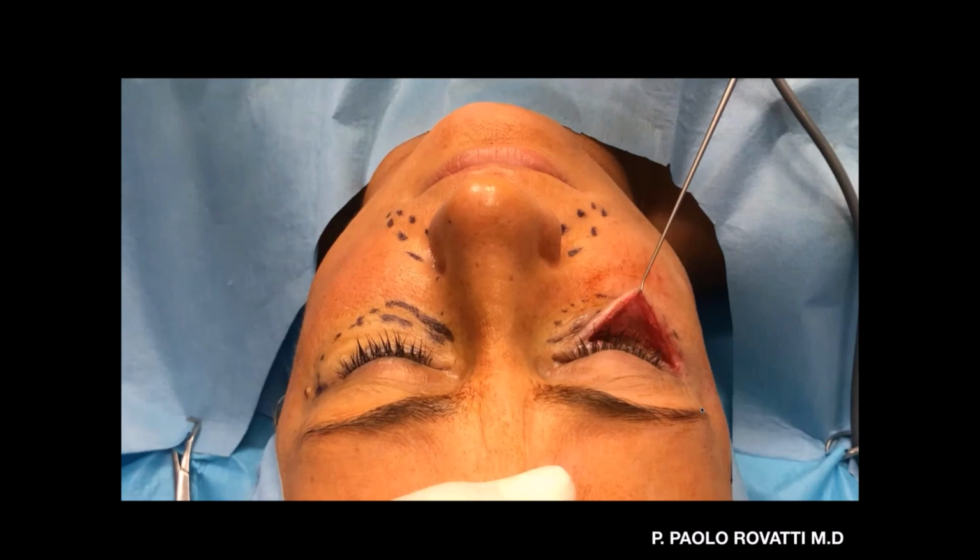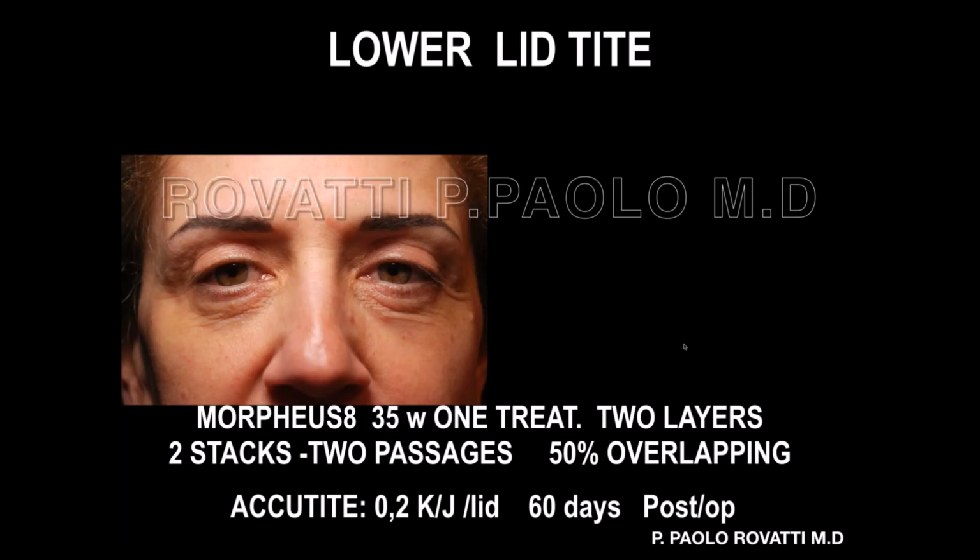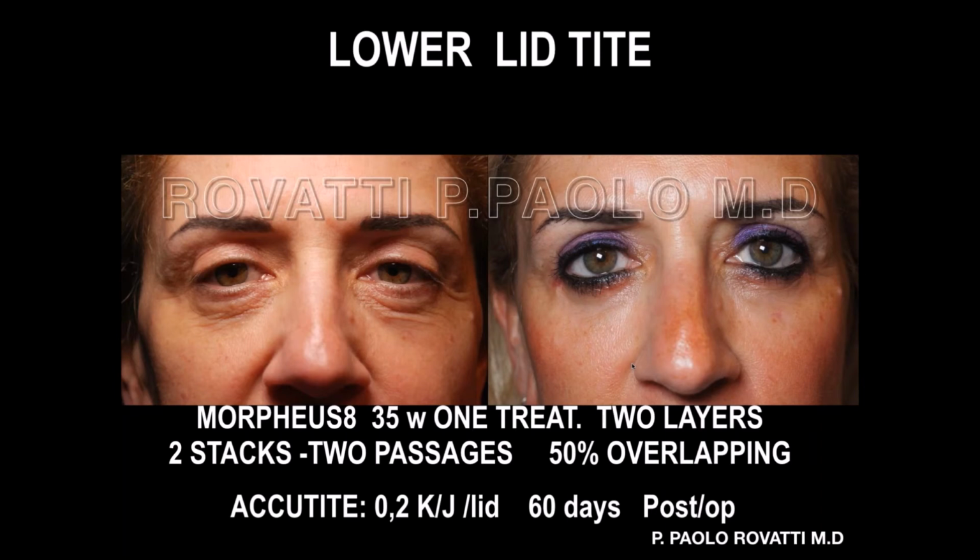So, starting from the mistakes, these are one of my first cases, a few years ago, 2 years ago. After Morpheus treatment and AccuTite, after 2 months, what I can see is a good result for the patient, not so good for me. You can see that on the lateral canthus you have a little scleral show, but no problem, no issue. The patient is not complaining about this problem. No hyperlacrimation, nothing else. I only asked her, do you like this treatment? Yes, I like it very much.